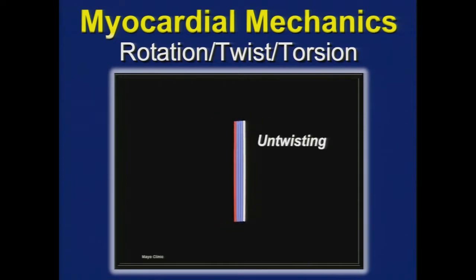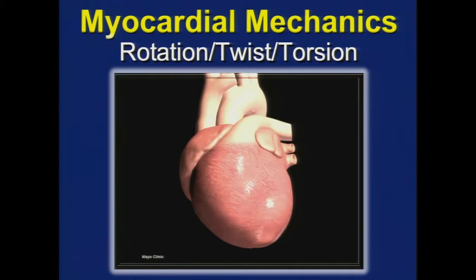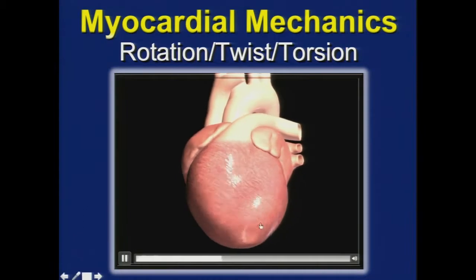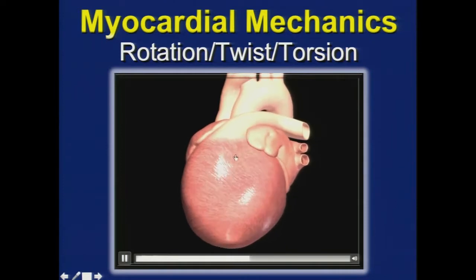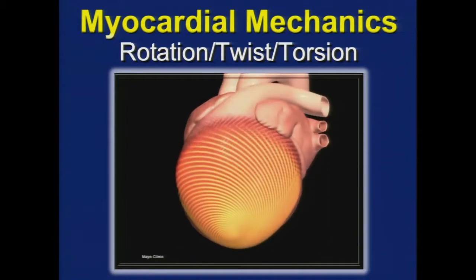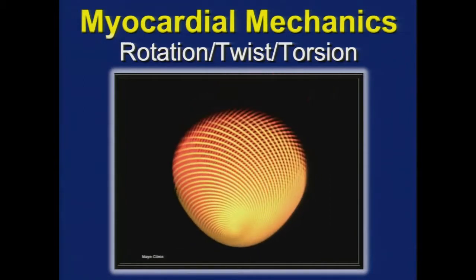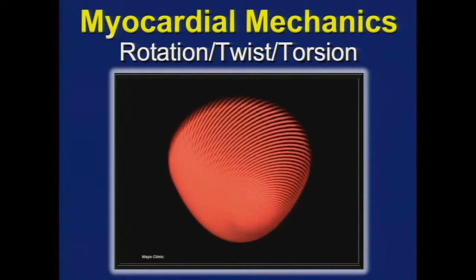And so if you look at global ventricular function and the relationship between myocardial form and function, you realize here, you see that in systole, the apex of the LV seems to be rotating in one direction. The base is rotating in another direction. It's really causing this wringing effect, literally propelling these spiraling streams of blood through the LVOT and the aortic valve into the systemic circulation.